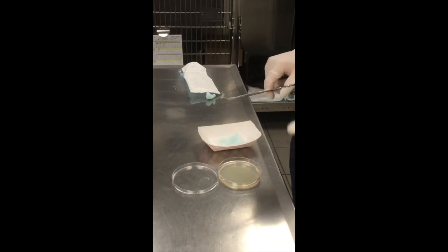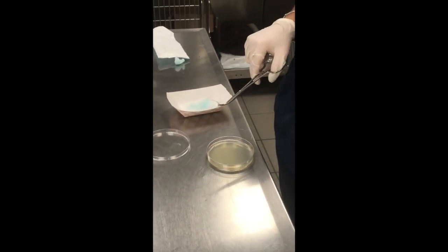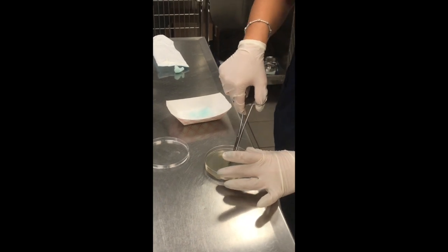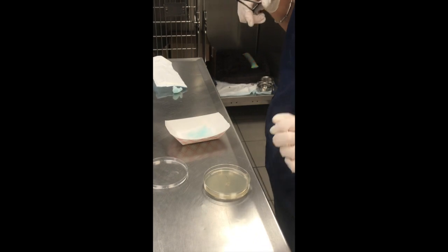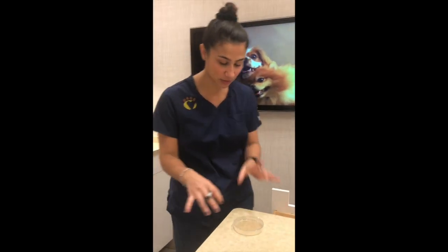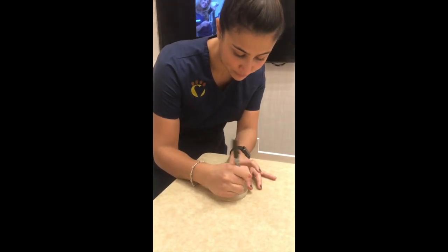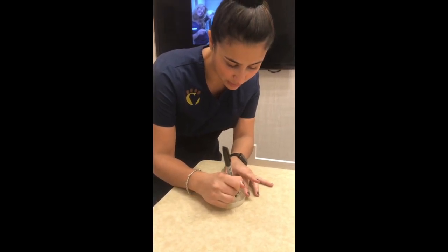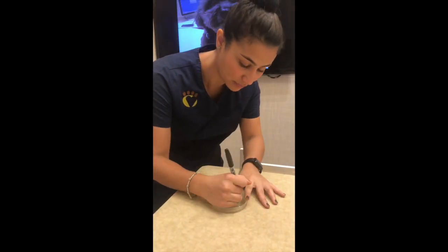And then I'm going to lightly press it into our plate here. It doesn't have to be aggressive, just lightly press. Just like that. Okay, so now we have our plate here, which I'm just going to label. First I'm going to write our date, which is October 31st, 2018. Then I'm going to write the time we took it, which was around 11:40 a.m.